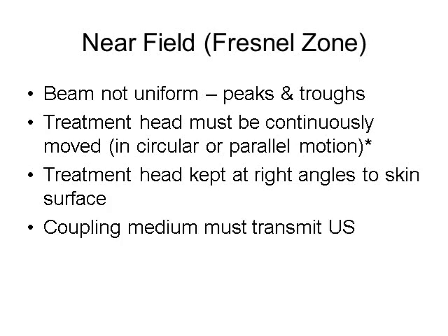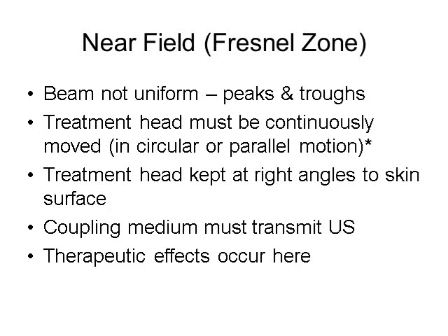A coupling medium must be used to transmit the energy from the treatment head into the tissues. This is usually an aqueous gel which transmits almost all of the sound energy into the tissues. The therapeutic effects of ultrasound are attributed to the action of ultrasound waves in the Fresnel zone, because in the far Fraunhofer zone, the wave has weakened substantially.